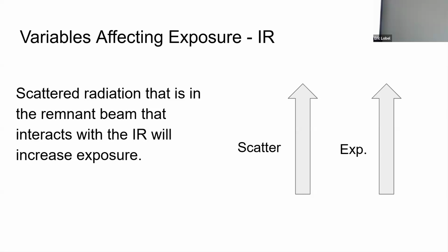But our systems now are very, very good at getting rid of scatter, so much so that the algorithms on our portable machine now do what's known as noise reduction, which some people might refer to as a virtual grid. But what it really is, is an algorithm, a mathematical set of instructions to reduce noise. Because we just said scatter really takes the appearance of noise, if you reduce noise, you're reducing scatter. Either of those going down, whichever term you want to use, means contrast goes up.